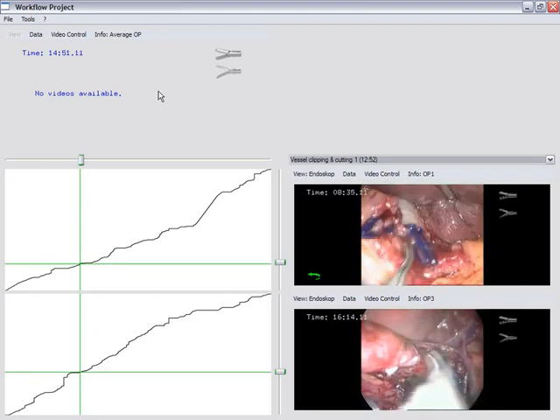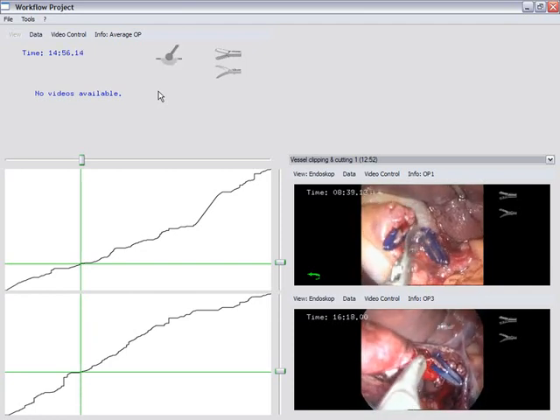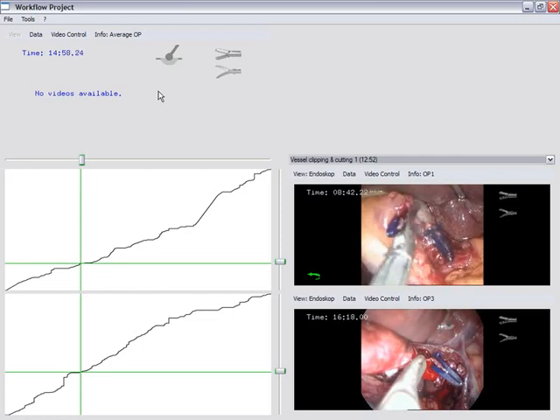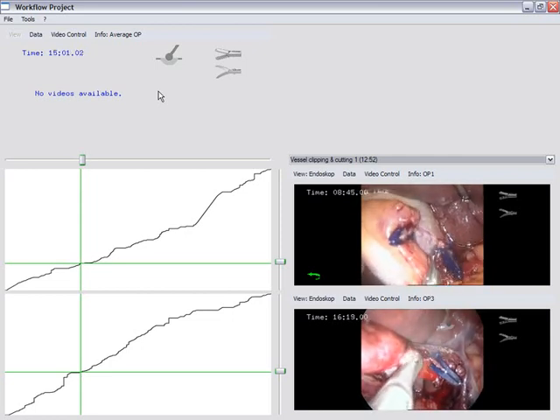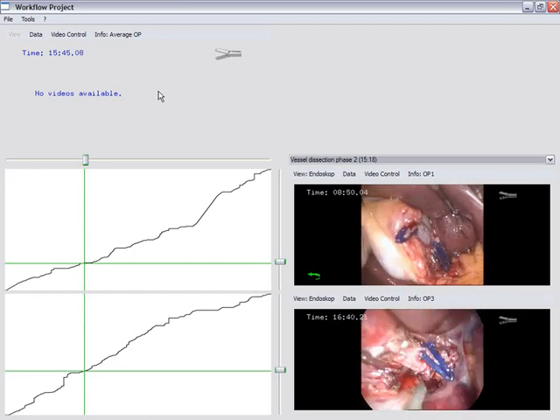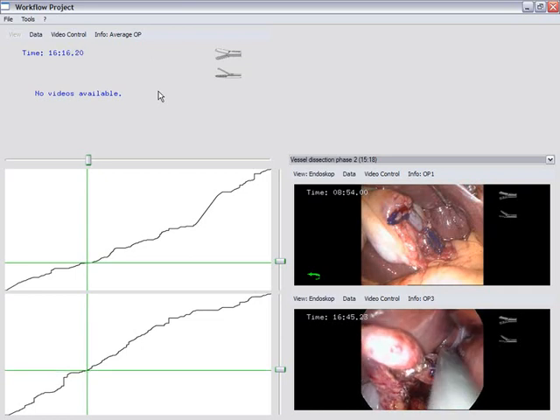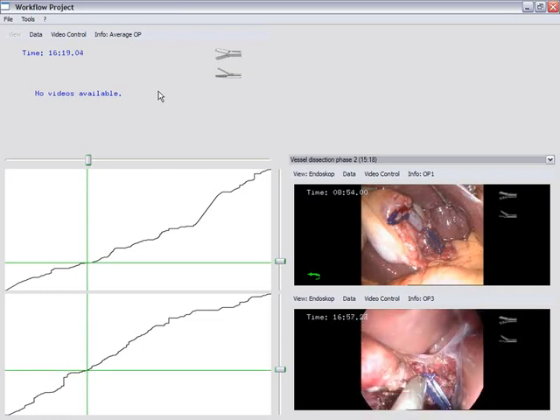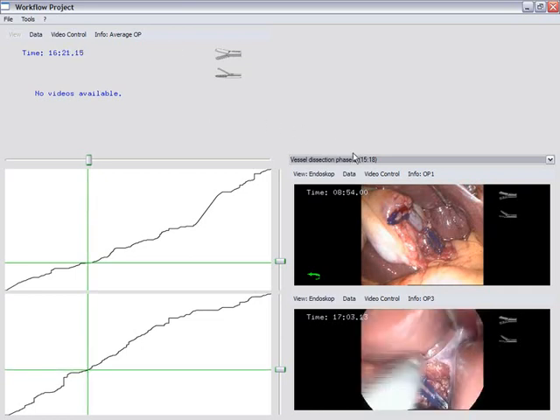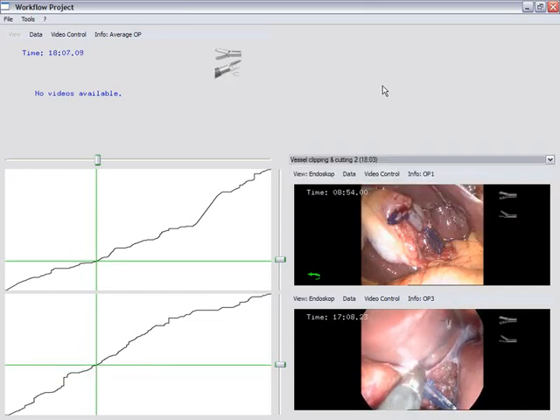The common action of cutting the vessel is displayed simultaneously again. While 3 clips in the upper video are enough to conceal blood flow, the vessel in the lower video is sealed by electrocoagulation. This demonstrates the capability of our system to correctly classify actions within multiple surgeries into distinct workflow phases. The video playback elegantly respects slight differences in the workflow.